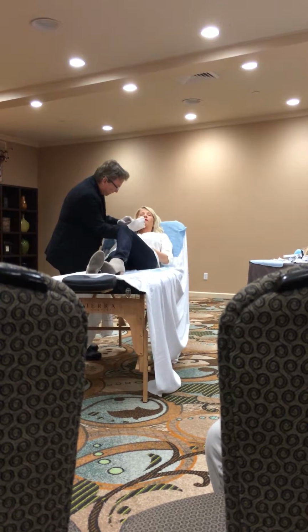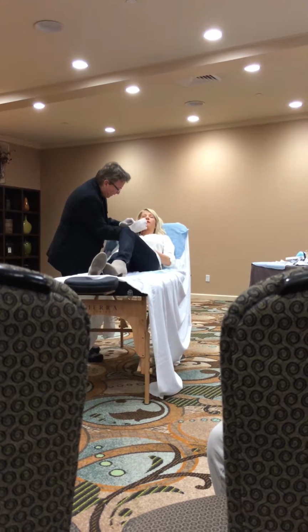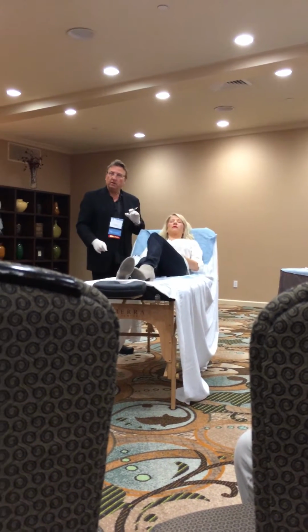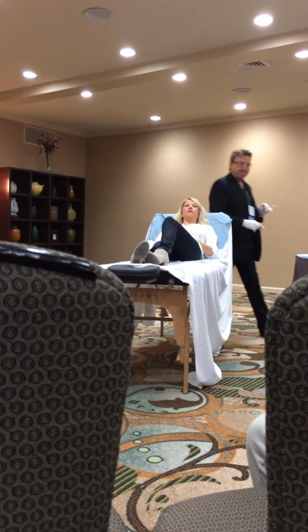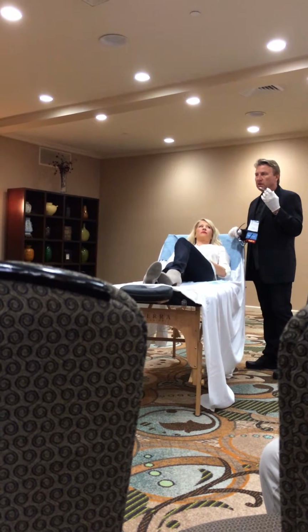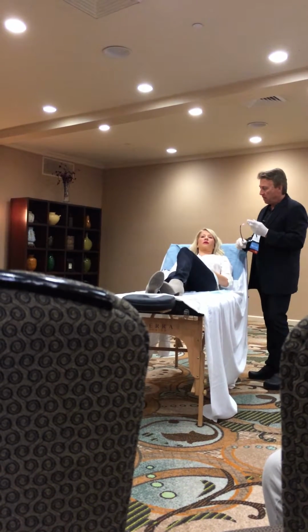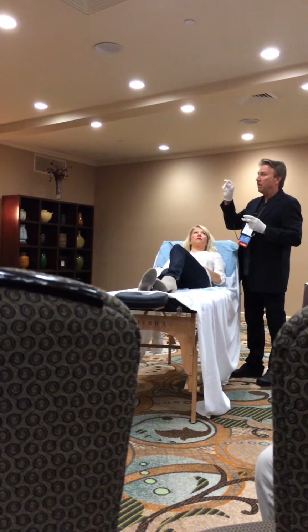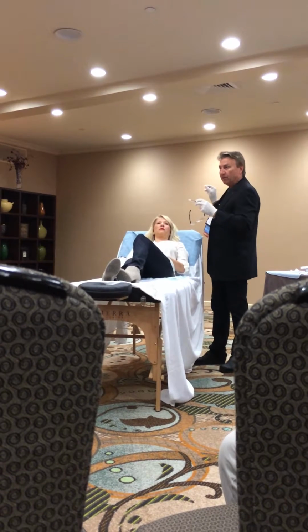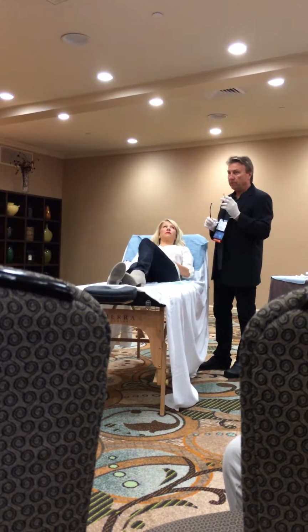Doing very similar to what we saw before. Is that hurting at all? So you guys are seeing this up close. It does a nice fill. It seems like when you push it, it's a little less viscous. So to answer your question, which is a good one, I don't see as much of the bump. Sometimes you'll inject and the product will squirt laterally and there'll be a little bump there. I see less of that. It can still happen, but I think it's less.